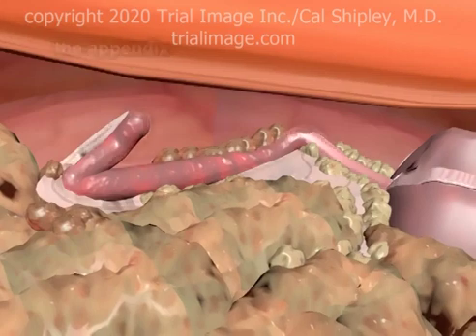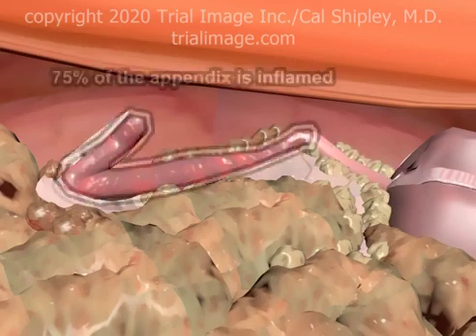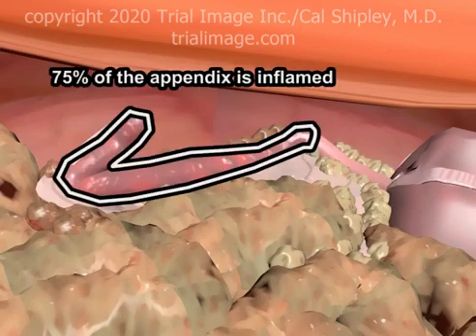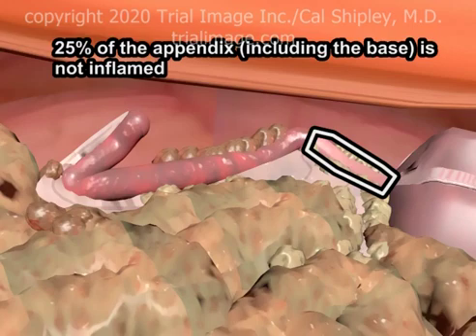At the completion of this dissection, the appendix can now be fully visualized. In this example, about 75% of the appendix has become infected and inflamed. About 25% of the organ, including the base, is normal.